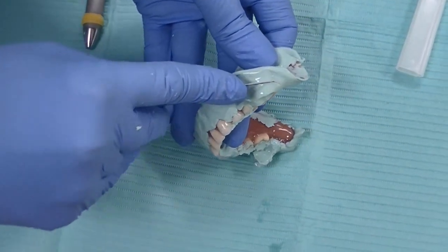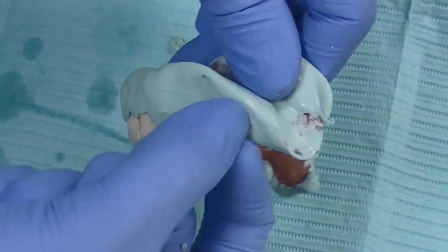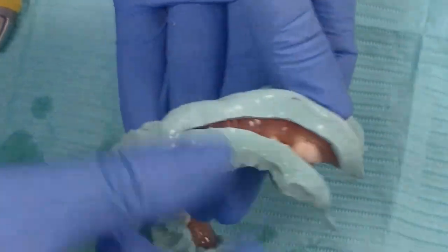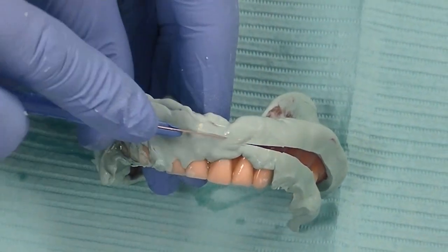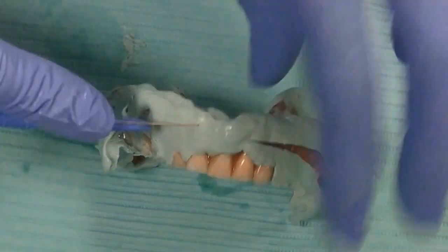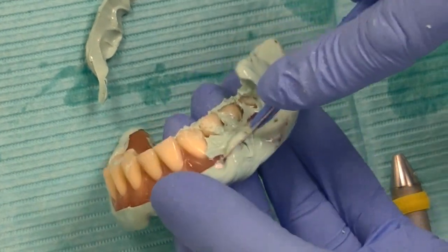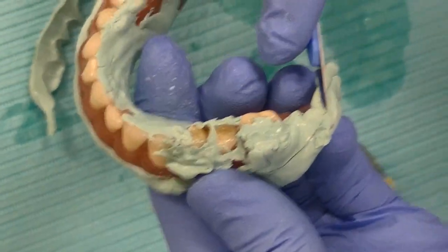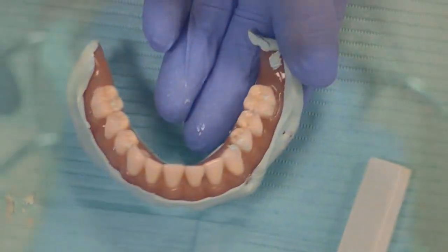Using a 15 blade or a Bard-Parker handle blade, we lightly trim all of the excess radiopaque impression material. It's important to get a nice roll of the border here — the roll of the border ensures that we have radiographic appearance of this material in the CBCT scan. Being careful and gentle with the blade, just watching our fingers as we trim and carefully teasing this away. If you have a little bit of excess, this actually helps us to have a slightly irregular cutting surface — meaning you don't want it exactly perfect all the way around. You do want some thinning of it and some of those points.